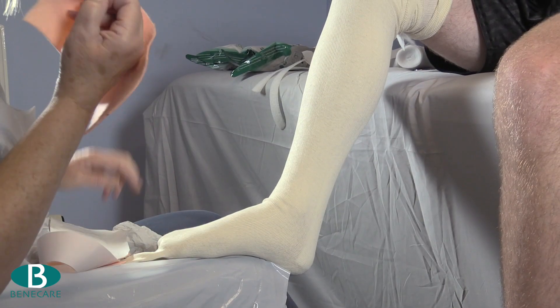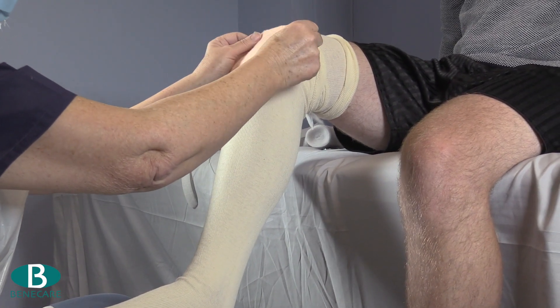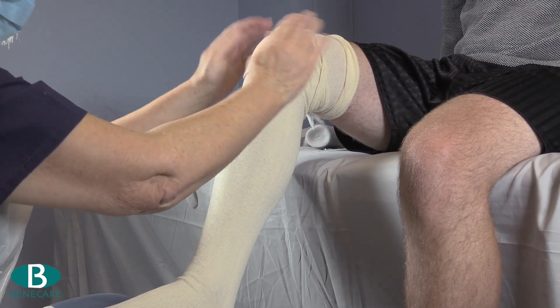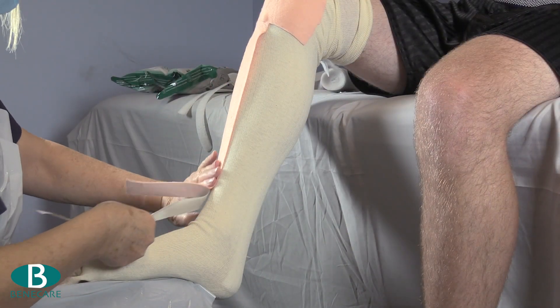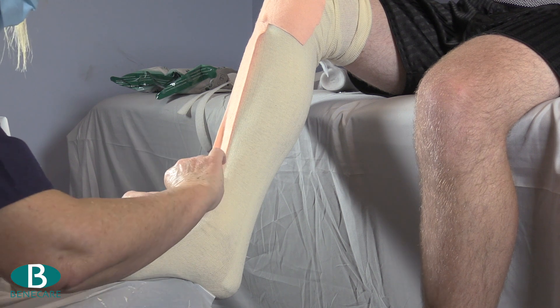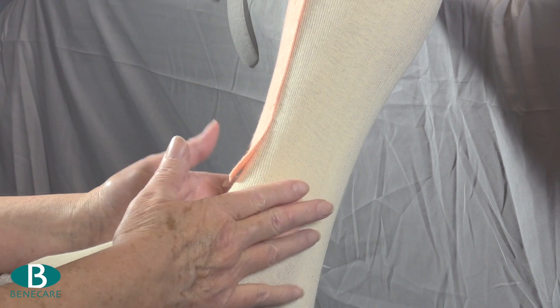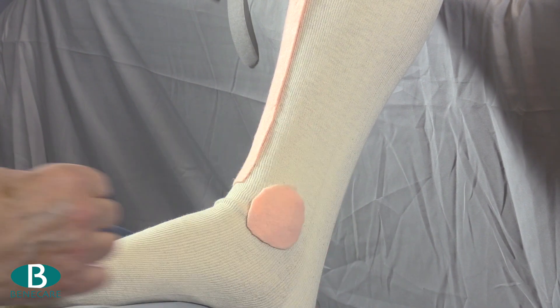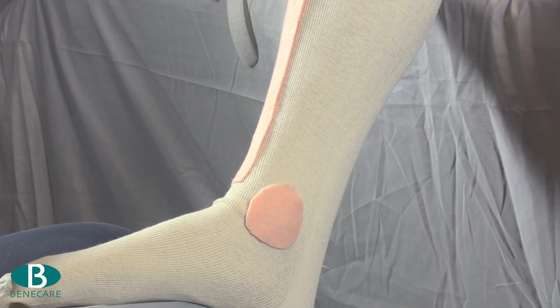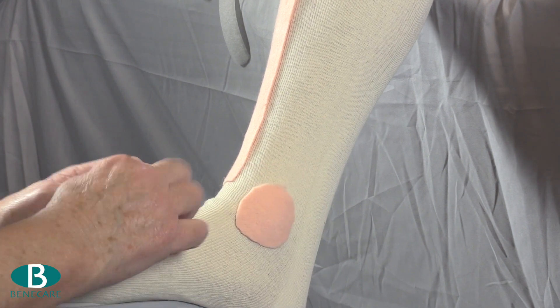Now using fleecy web for protection to the bony prominences — felt negative padding could also be used. Place a large piece to the knee that will cover the patella and epicondyles of the femur, then a long strip down the tibial crest and additional circles to protect the malleoli. Additional protection can be applied at the distal and proximal end of the cast if required.